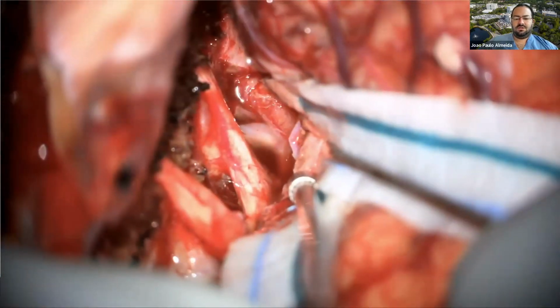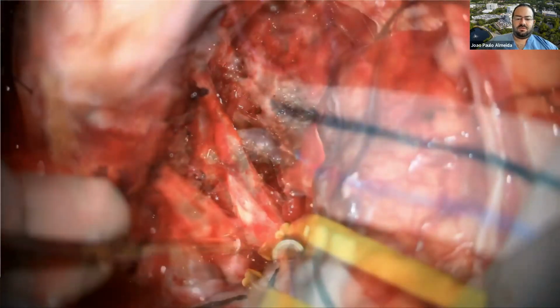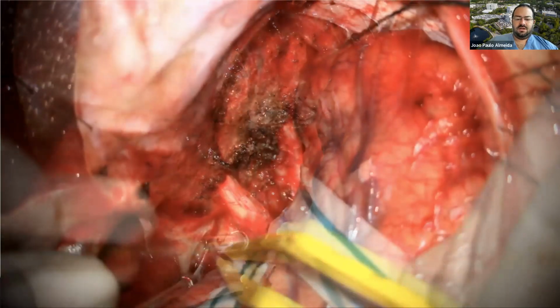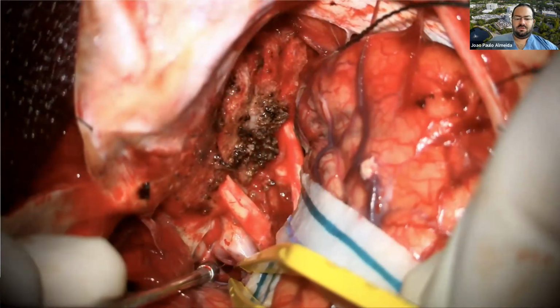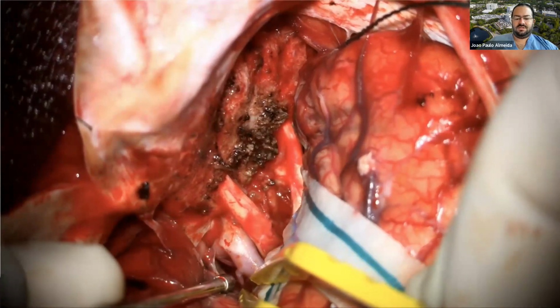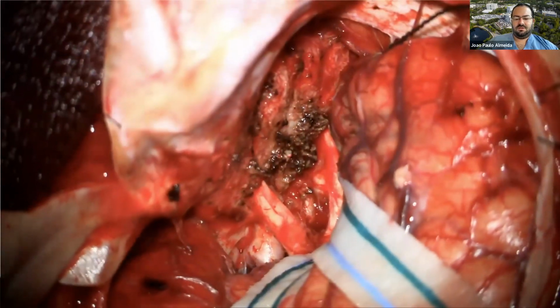And then that was just showing the surgical cavity, the contralateral carotid, ipsilateral optic nerve on the left and the right. And you can see here some of the blood being cleaned, the PCA on the left, third nerve on the left side as well. You saw a glimpse of the superior hypophyseal.